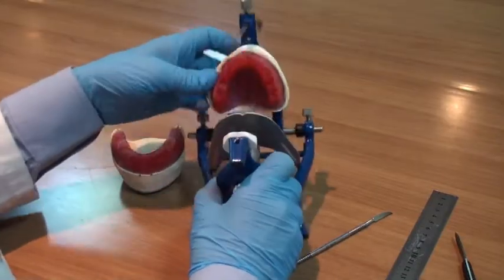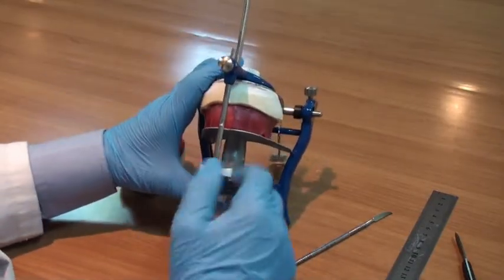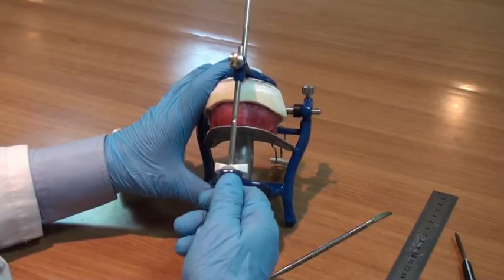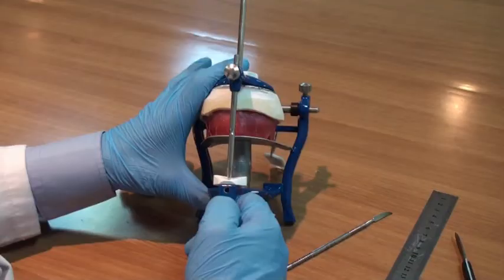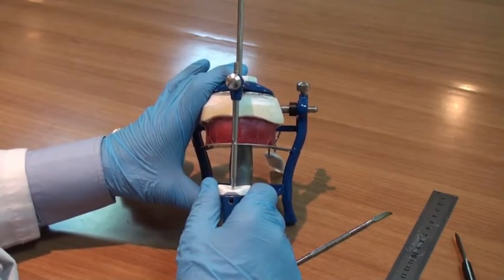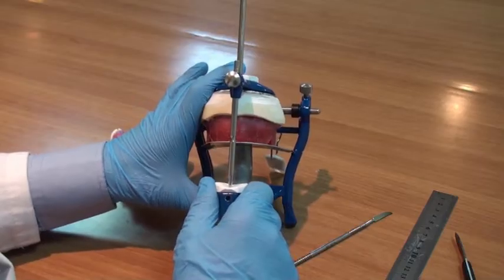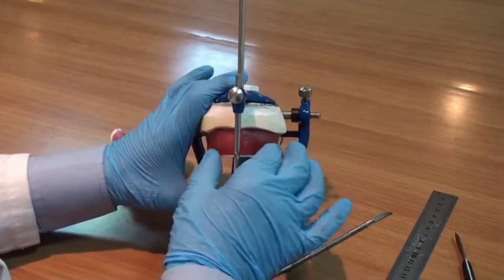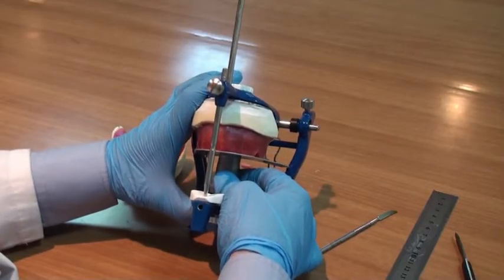Now this will coincide exactly with the occlusal plane established and registered by the wax rim. Preservation and protection of the proper occlusal plane established at the maxillary wax rim inside the patient's mouth has been secured by the occlusal table.